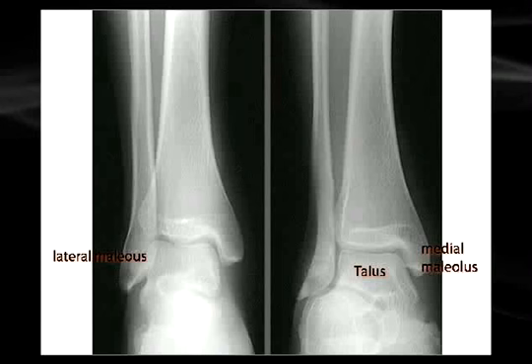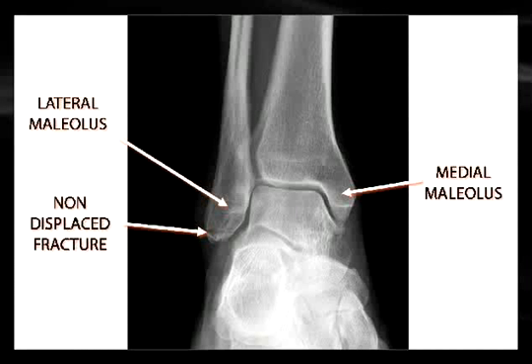Take a moment with this image for self-review to get familiar with which bones are visible in which views. Also note the malleoli and the fibula in this ankle X-ray AP view — you can see a tiny fracture on the edge of the lateral malleolus, which is an avulsion fracture.